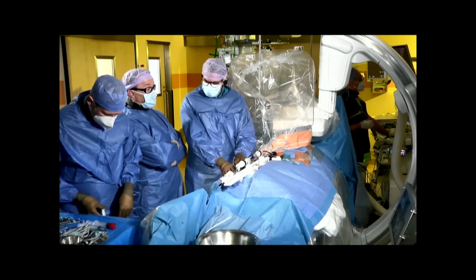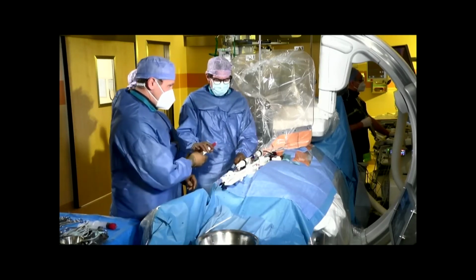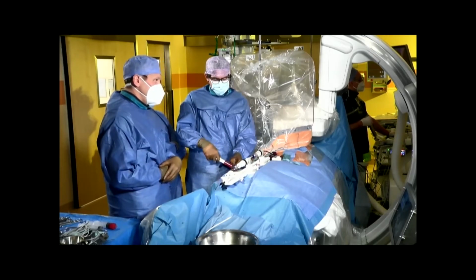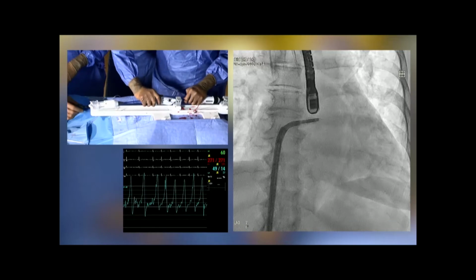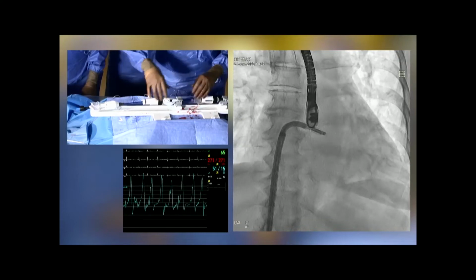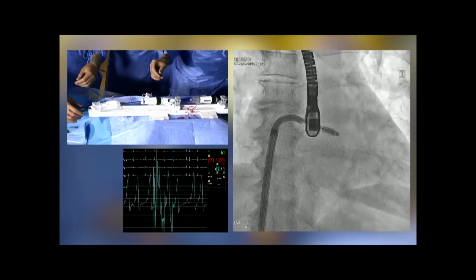Especially in this case, we have high LA pressures, we have a very significant V wave, and I very much hope and expect, if we do it right, this pressure to come down during the first grasp. Yeah, I do this as well. I always have left atrial pressure monitoring, because it tells you right away if you have a good leaflet capture when you close the system, and if you have reduced the MR effectively, even faster than any echo assessment.